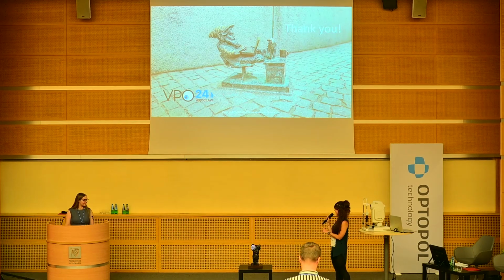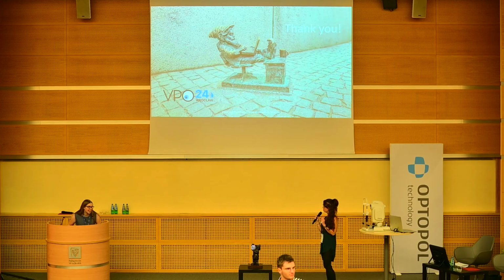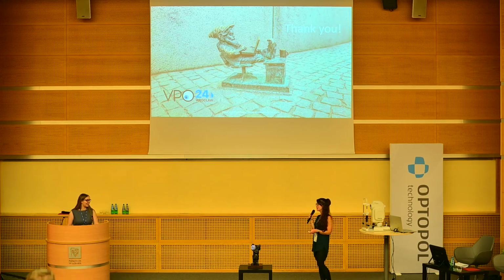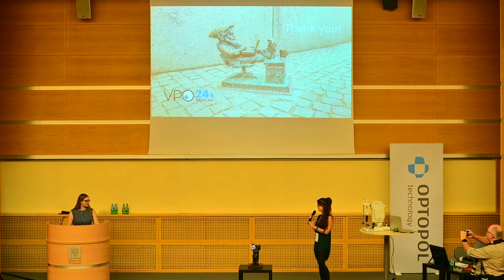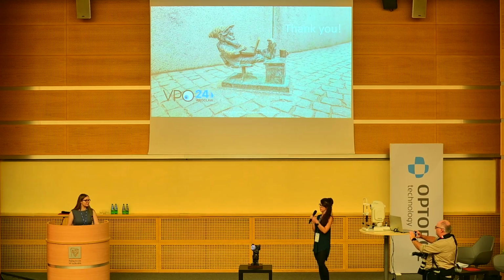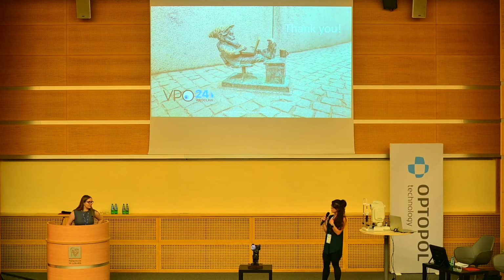I have one question. So you said you like NIBUT. Do you really feel that thermography could substitute NIBUT in the future? Because my thinking is maybe NIBUT is more variable between different measures, but I feel like the thermography depends much more on the external factors. It's very affected by the temperature, humidity, and even, I think, the body temperature.